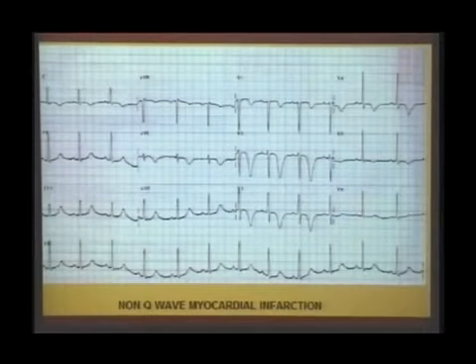But the important clue here is, many times the patients who are coming to you with this type of change, which is a symmetrical deep T wave inversion in V2 to V3, non-ST elevation situation, troponin positive, if you discharge these patients, they will come back within 2 to 3 weeks with a massive ST elevation MI. Because this sign of T wave inversion, V2, V3, which is called Wellens sign, represents critical occlusion of LAD.